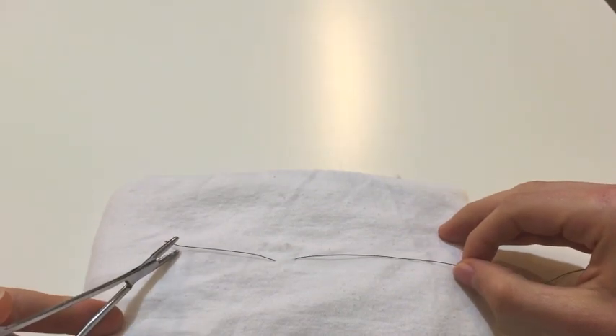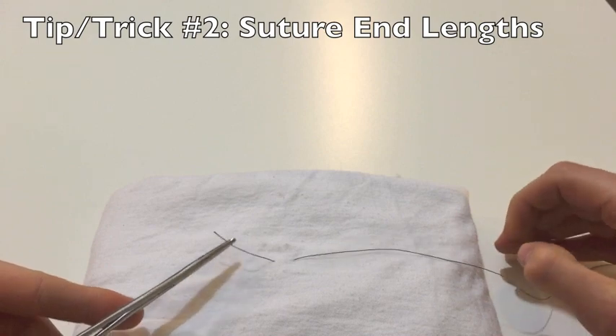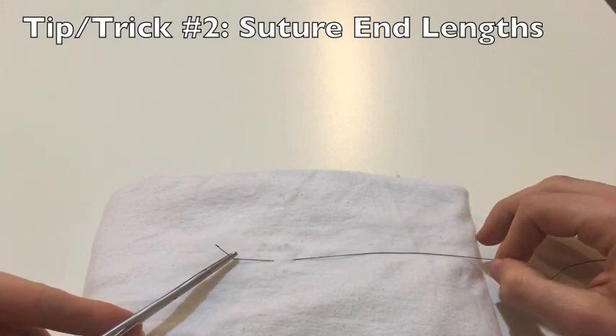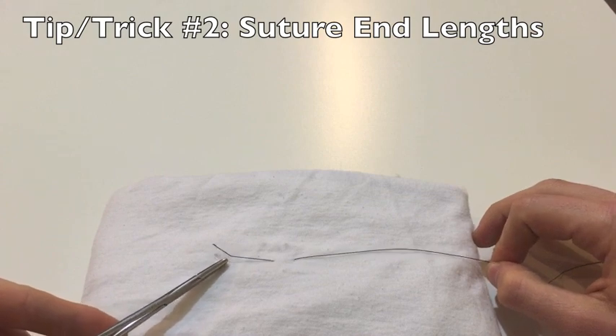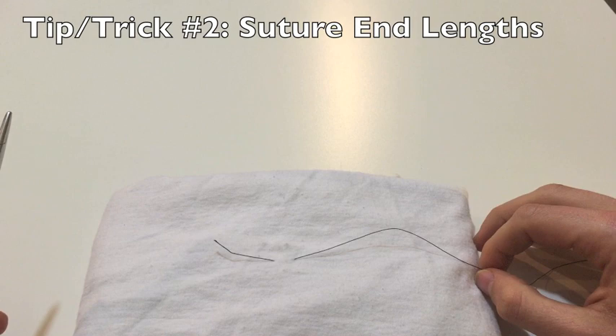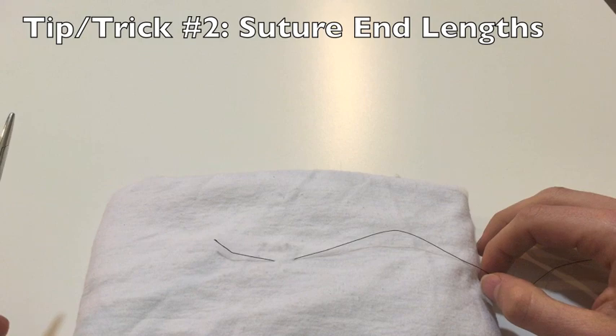The second tip is going to be about the length of each end of the suture. I'm going to call this end the free end and this end the needle end. The free end should be on the shorter end — here I have it at around 4 to 5 centimeters long. This is short enough that I'll save suture and can throw multiple knots with this single string. However, I need to make sure it's not so short that I won't be able to throw enough knots and get a long enough tail.